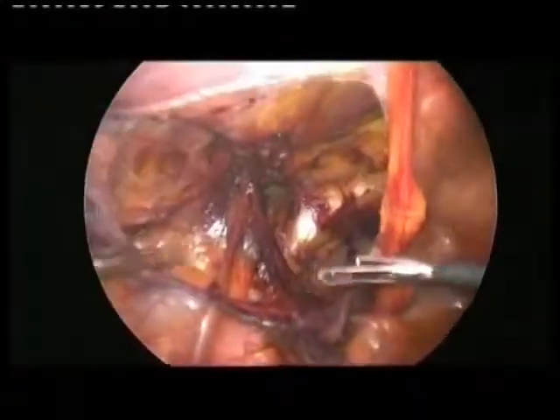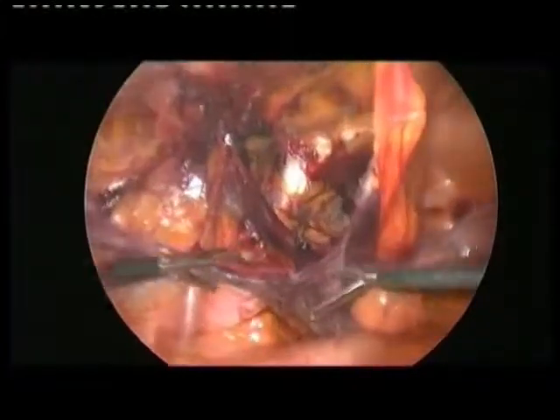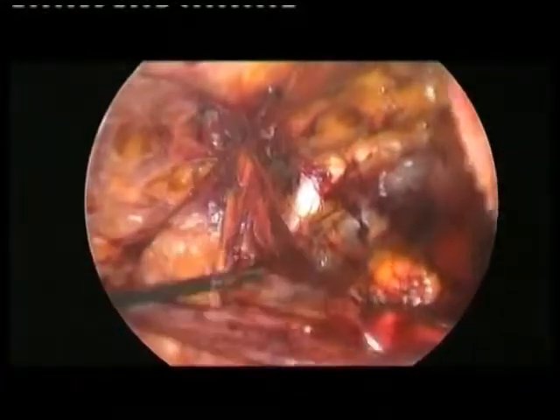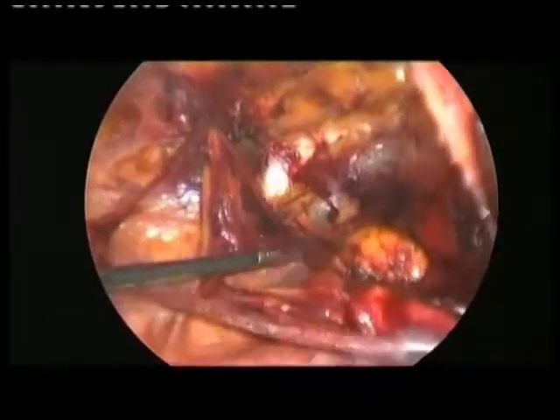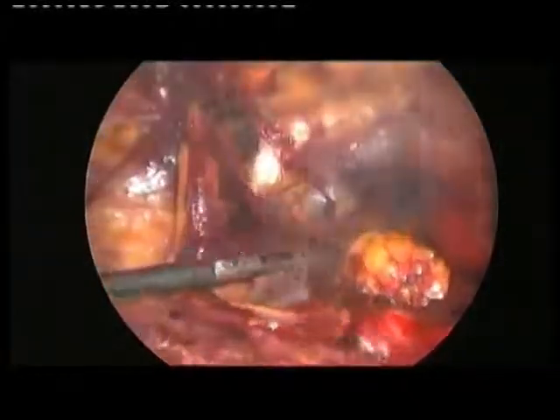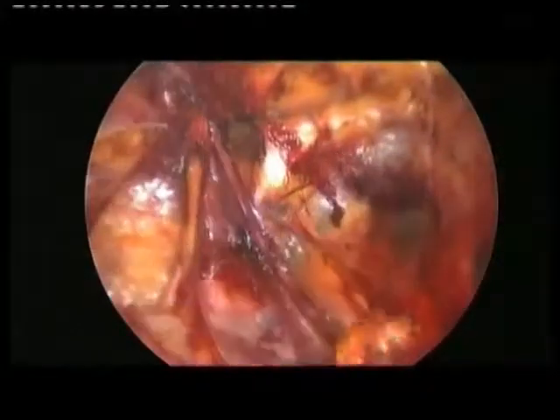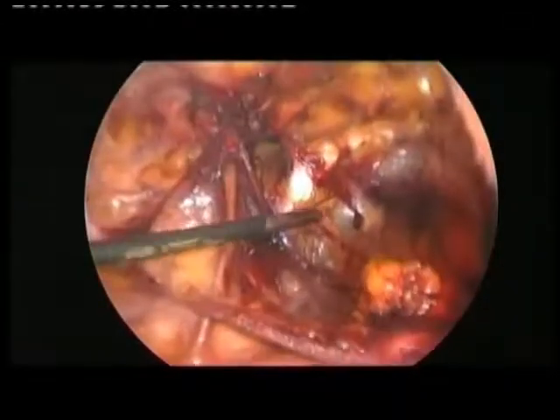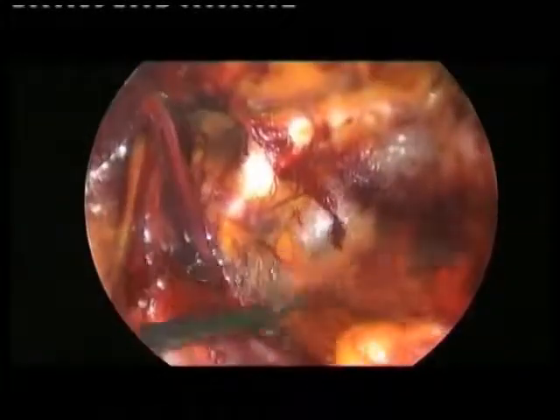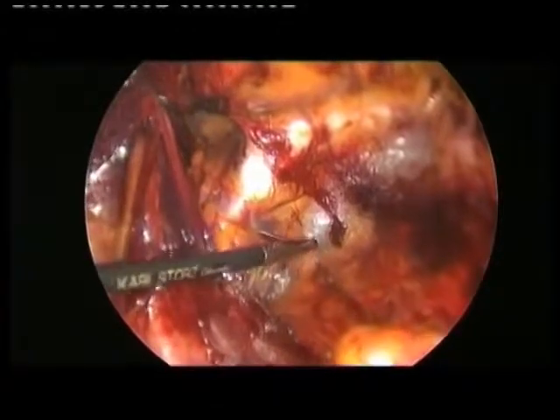Okay, that's enough. At the beginning, it's difficult to understand when the preparation is enough and when it's not enough. Usually, I repeat, it's better to prepare more because when you have put the mesh, it's more difficult to go back and prepare more. Okay?